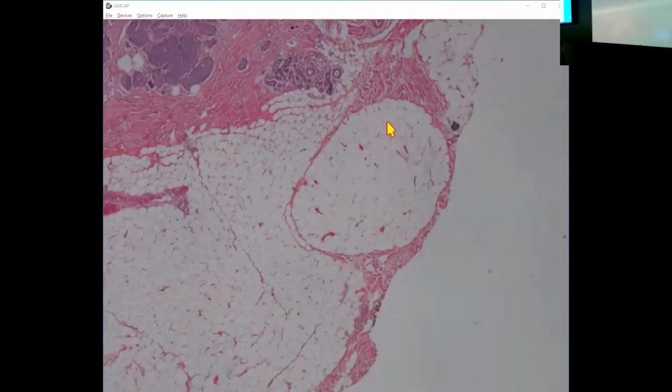So this is a young woman, 30, what is it? The slide is 36, the female is 58 with a breast mass and calcifications.